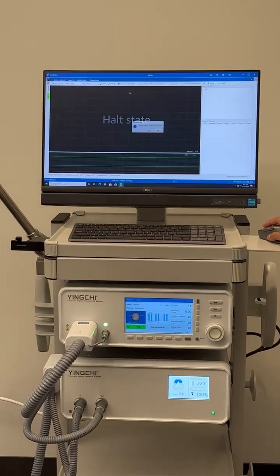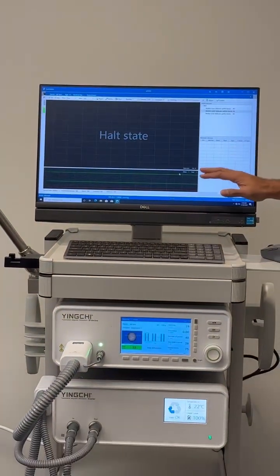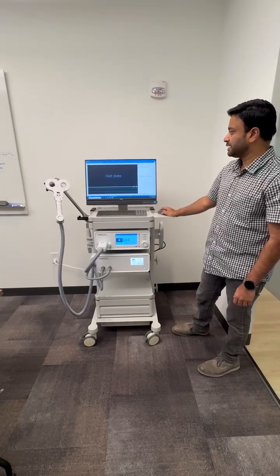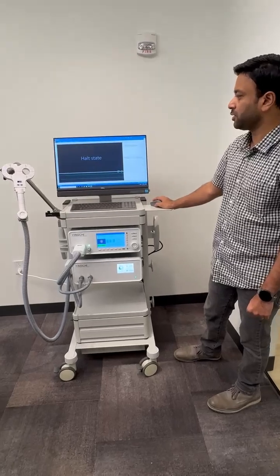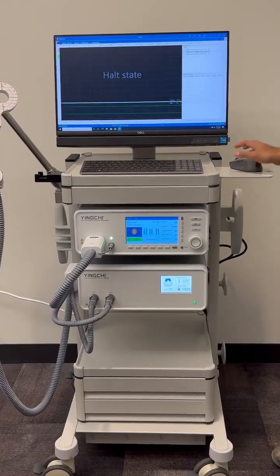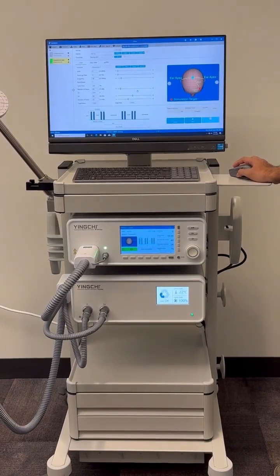You go into the motor threshold button and create a new project for abductor pollicis brevis, and this is where you would have the MEP traces if the MEP module is connected. Right now we do not have the MEP module connected, but that's always an option. Over here you can select the intensity of your motor threshold by sliding this bar, or you can also control it from the coil itself. The process would be to test the motor threshold in different increments, but for simplicity's sake, let's say our motor threshold is 30 right now. You confirm, and you get out of it.